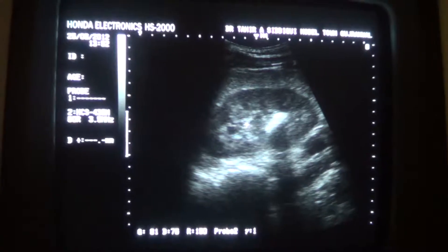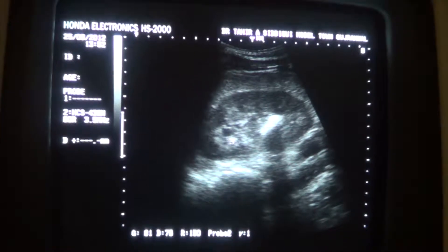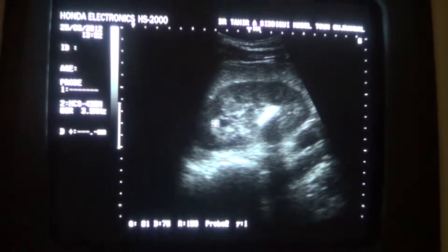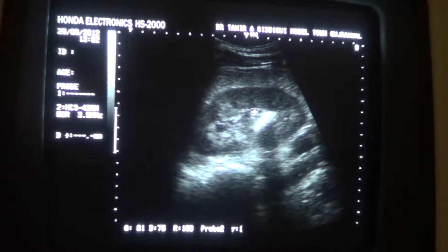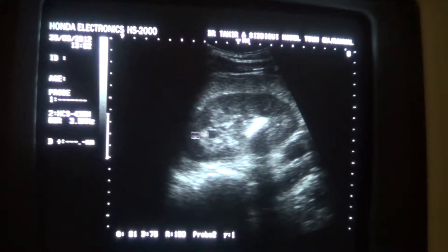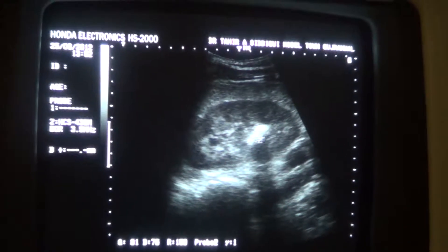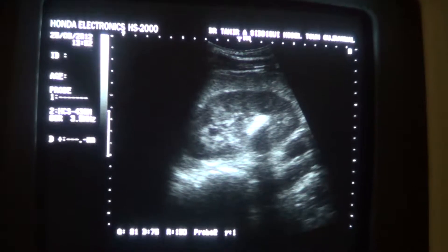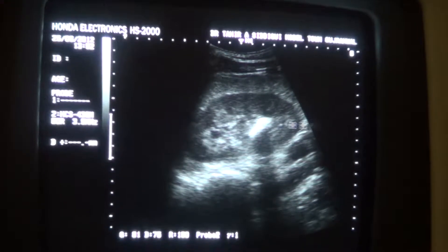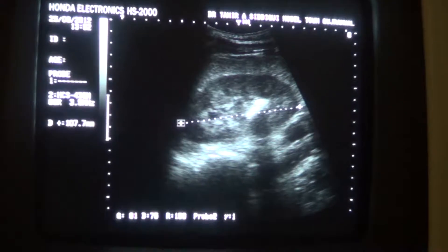There is minimal hydronephrosis. These wide areas are those of central sinus echogenic complex fat and minimal hydronephrosis with the calculus. This is the longitudinal section of the kidney. The kidney is normal.